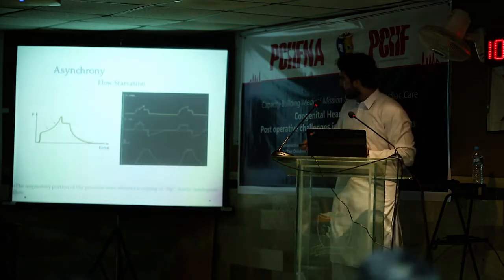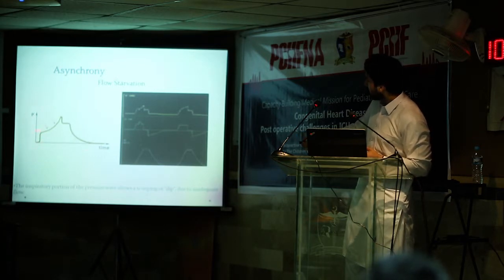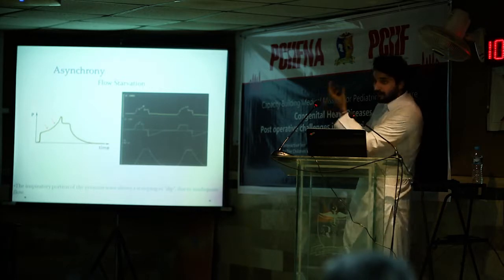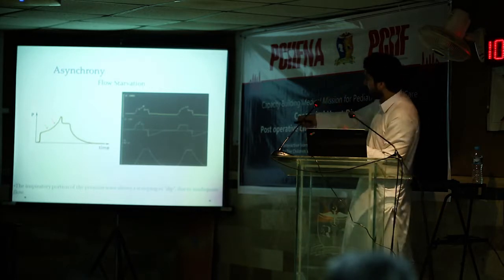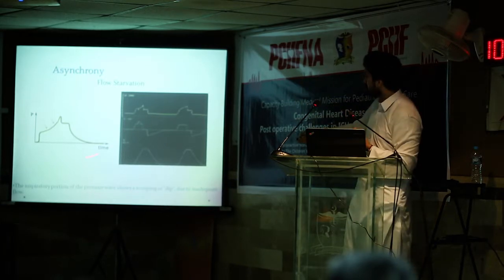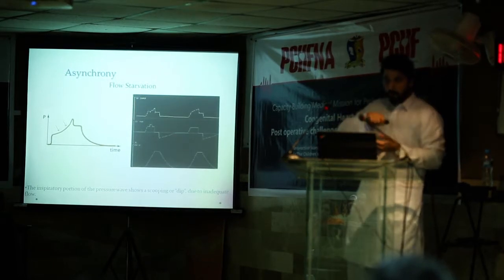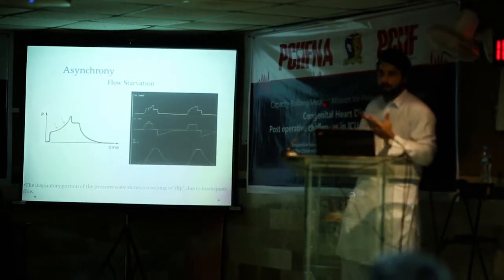So this is asynchrony. It should be like PEEP, plateau, come down. But look here, we call it a scoop, or a dip sign. Here the patient is inhaling above the inhalation. This should be the inhalation, but he wants more. So this is airflow starvation, or air hunger. If you give him more flow, if you increase the flow here, he will be fine.